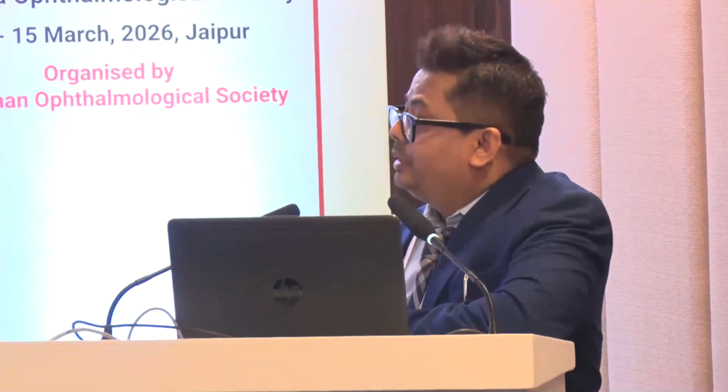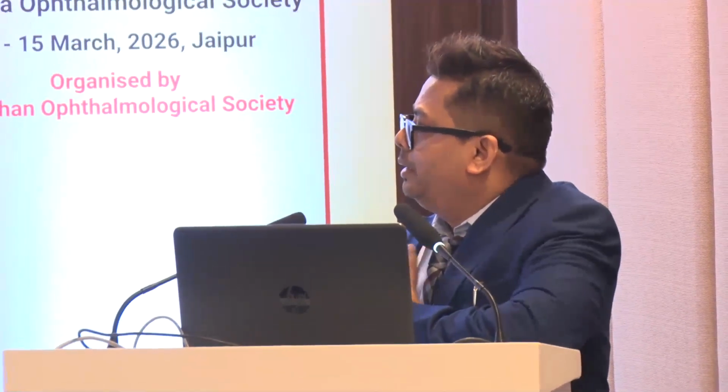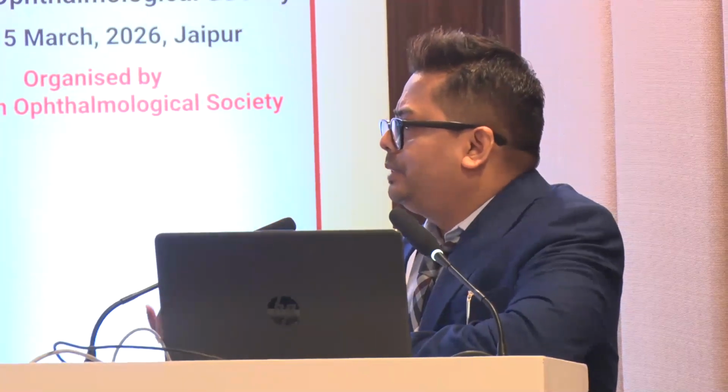What we convey is that, as we all know, when we implant the phakic IOL there is an immediate improvement of vision, and that improvement is the effect of the phakic IOL because of retinal image magnification, and we place the IOL close to the nodal point. That is all proven. But what I showed in this line diagram, for all 49 patients followed for more than 3-4 years, is that after 3-4 months there is another line of improvement, probably neurodevelopmental improvement.